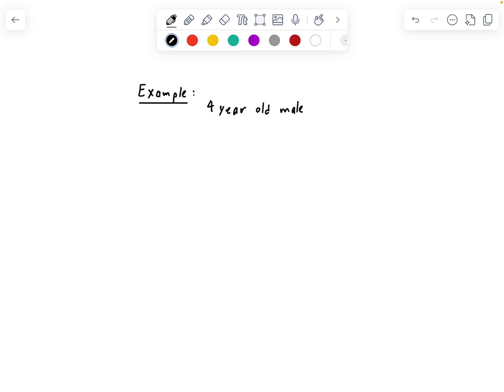Now, say you have a 4-year-old male who's coming into the emergency department in respiratory distress, saturating in, say, the low 80s, 70s, and you're trying to bag them up. They're not protecting their airway, and you decide to intubate. So let's go ahead and discuss what size ET tube one would use. Now, just for the sake of being thorough, we'll go through cuffed and uncuffed, even though in this scenario, the cuffed ET tube would be the one you'd use. So let's go ahead and get started.